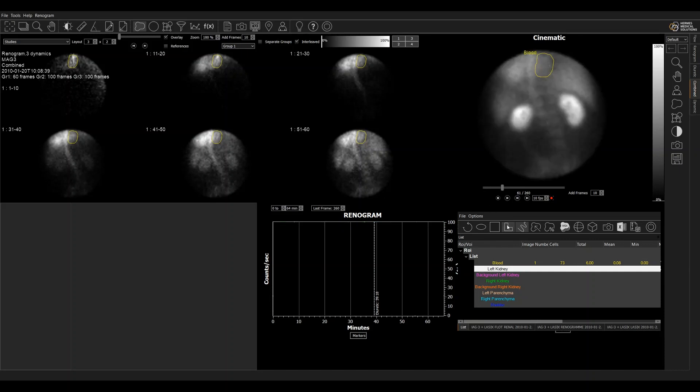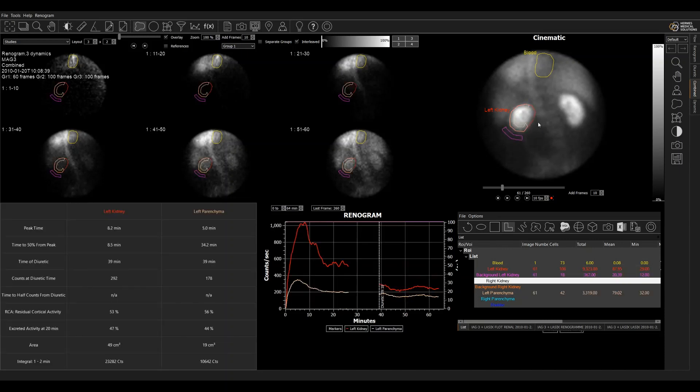I'll choose a different tool for this one. This is a rubber band method. You can click at each point where you want to make the region. Double click to finish. And then these regions, background and a parenchyma region, is automatically placed by the program. You can change those. You can redraw them if for some reason they're not appropriate for this patient.